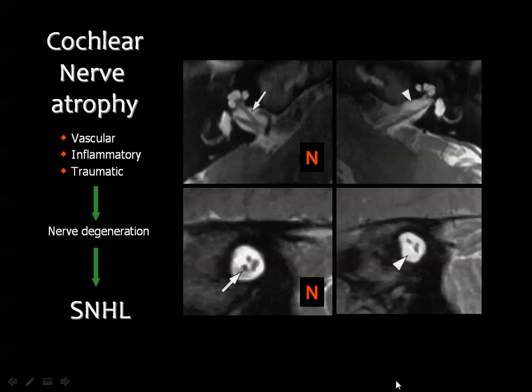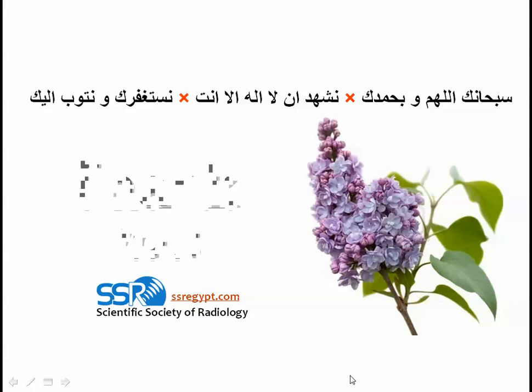And this is diagnostic of sensorineural hearing loss.